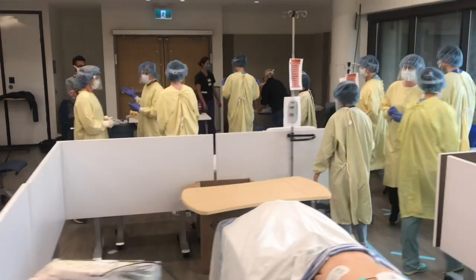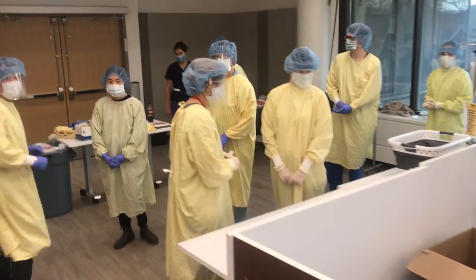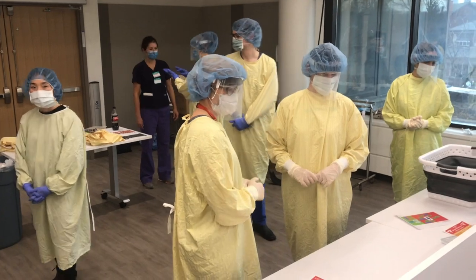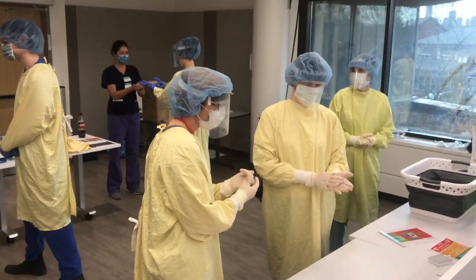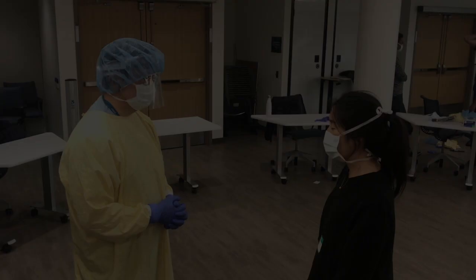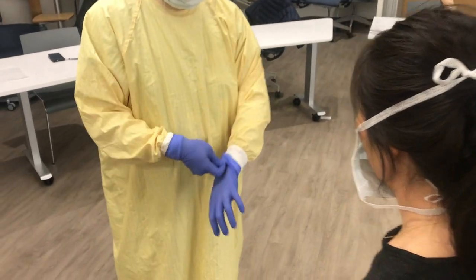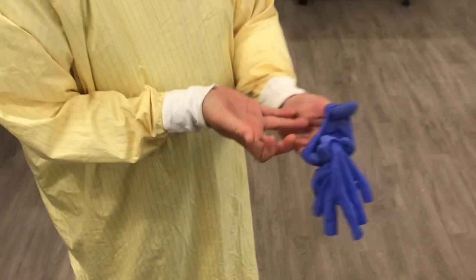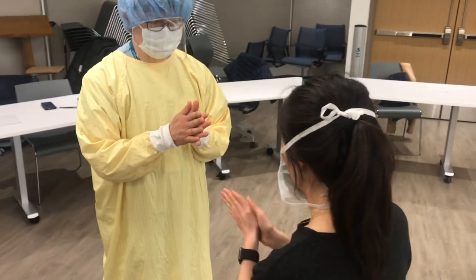So at this point, we are sort of breaking the fidelity of the simulation. In the interest of time, we're having everybody leave the room, and each person gets the chance to be the officer and coach the removal of the PPE by the other participant in a Simon Says fashion. Simon Says. And so here you can see Ginny Kim, who is going to be leading the person doffing through their doffing procedure. They're starting with the gloves, and Ginny is explaining step by step how to remove the gloves. Hand hygiene is very important.